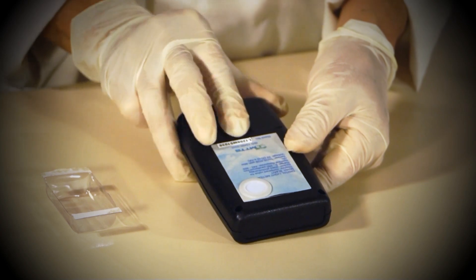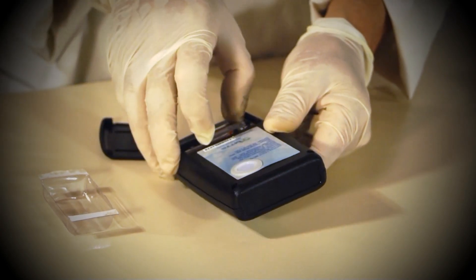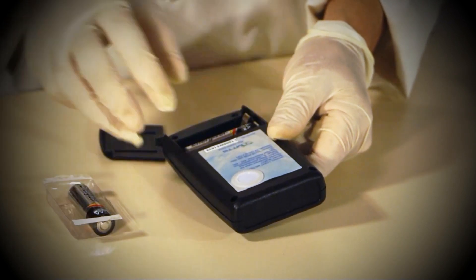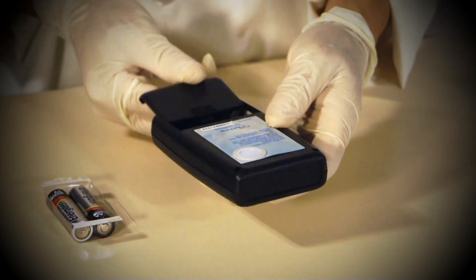If you don't use the light meter for an extended period of time, please remember to remove the batteries from the light meter. This will avoid damage to the unit and will preserve the device for long-term use.